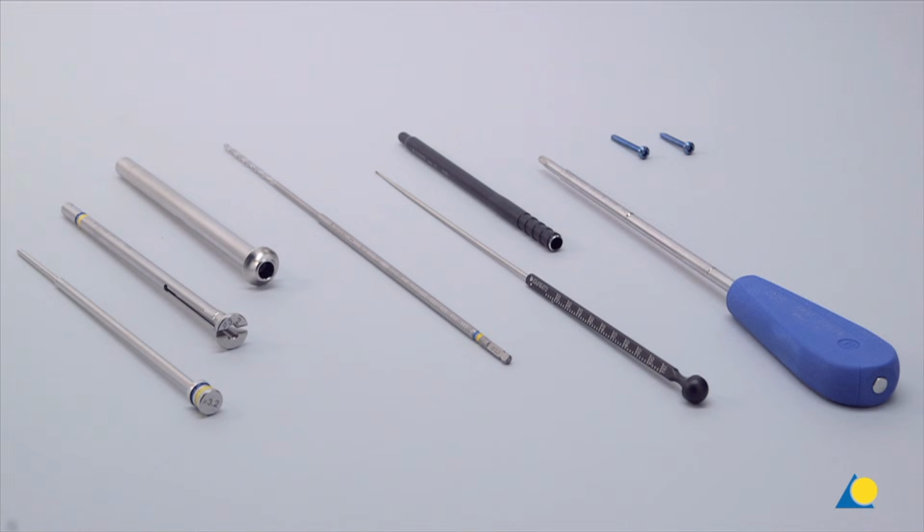The instruments needed for proximal locking include the trocar 3.2 mm diameter, the drill sleeve 8.0/3.2, the protection sleeve 12.0/8.0, the 3.2 mm drill bit calibrated, the depth gauge for locking screws measuring range up to 110 mm, and the screwdriver star drive T25 self-holding. Since a 9.0 mm nail has been inserted, two 4.0 mm diameter locking screws will be used.